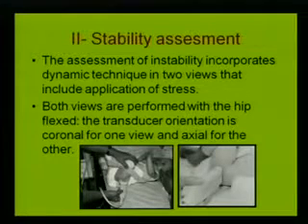The second step is the stability assessment. If we imagine you begin now to examine the patient, maybe in the first 5 minutes you have a full idea about the morphology of the joint by taking the adequate coronal and the transverse angle and taking the angle either in the ultrasound machine or afterwards in the PACS. I prefer to take standard views and then make the measurement afterwards in the PACS system.